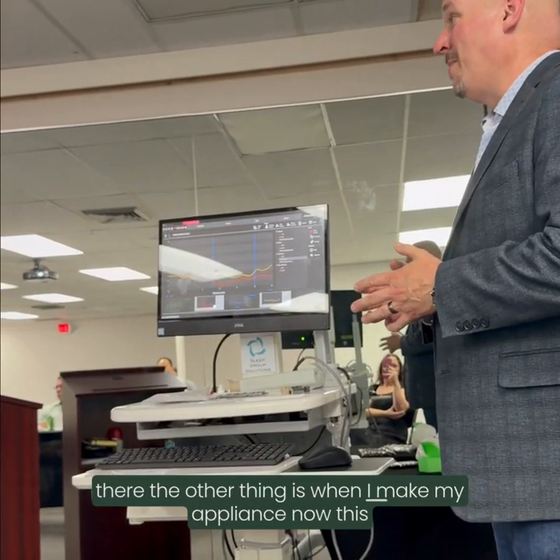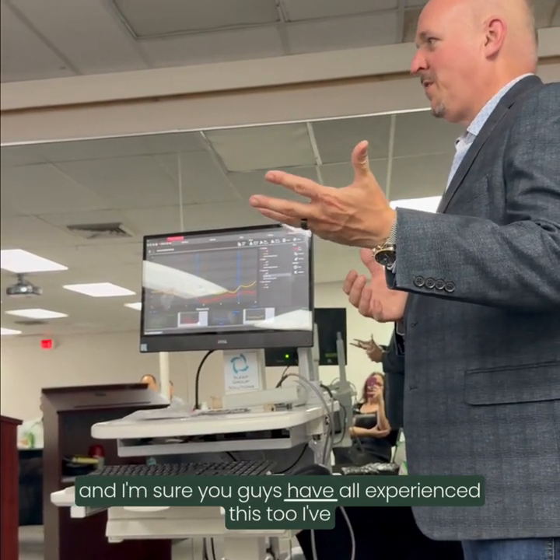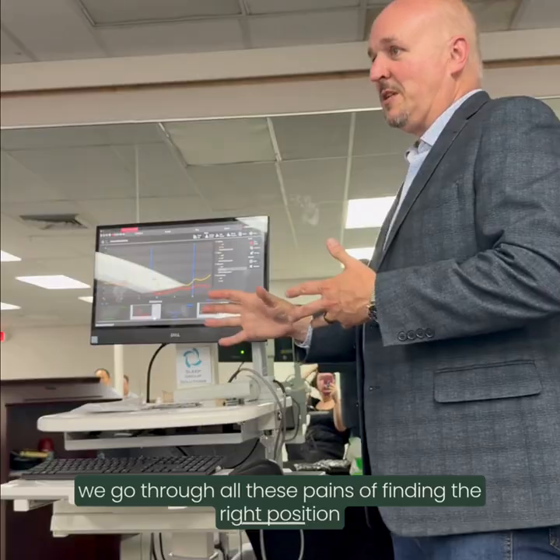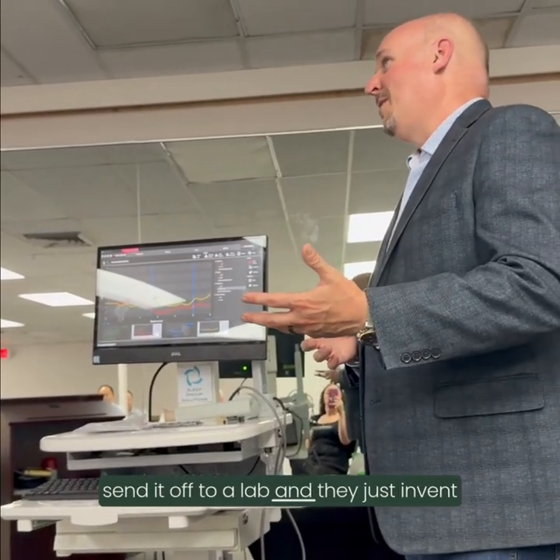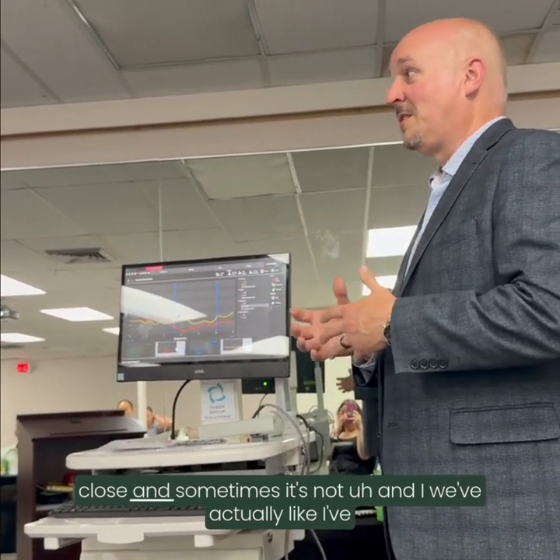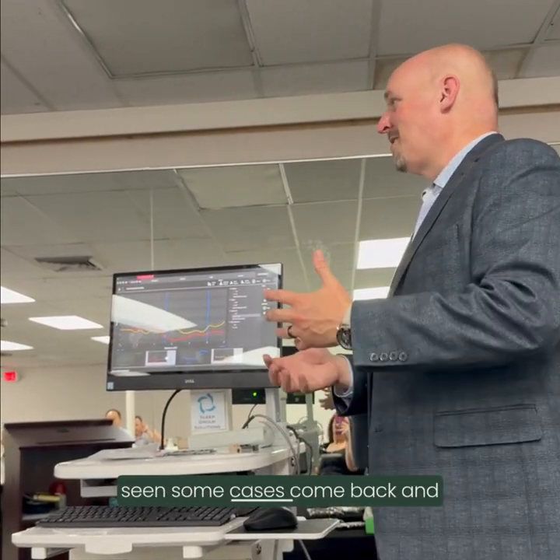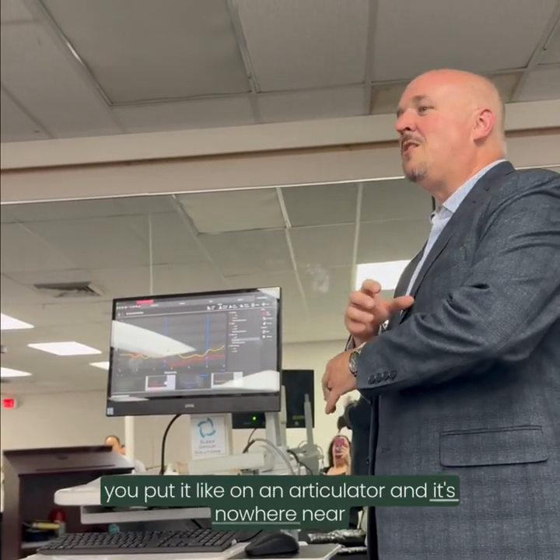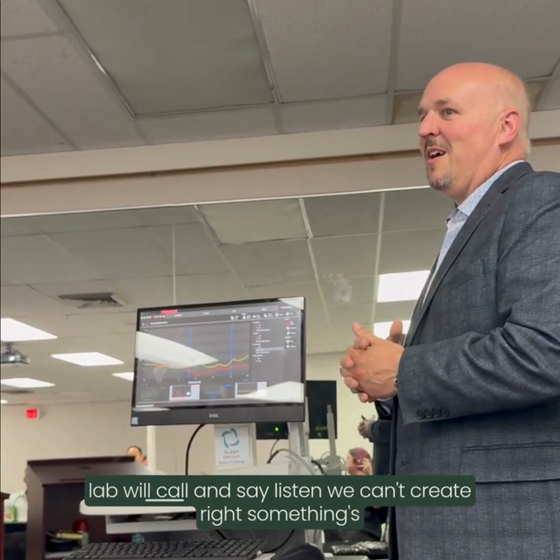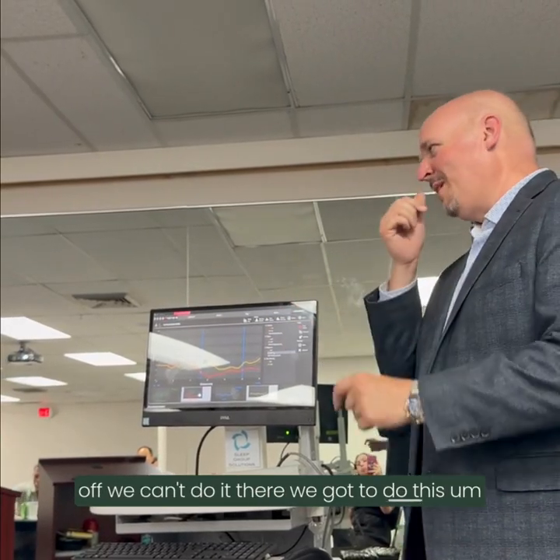The other thing is when I make my appliance, this comes to kind of a gripe with the different labs, and I'm sure you've all experienced this too. I've seen a lot of times where we go through all these pains of finding the right position, you send it off to a lab and they just invent their own bite wherever they decided to put it. Sometimes it's close and sometimes it's not. I've seen some cases come back and you put it on an articulator and it's nowhere near where your bite was. A lab will call and say, listen, we can't create the appliance, something's off, we have to do this.